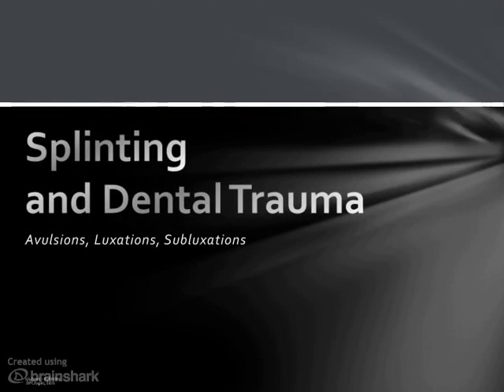In an earlier presentation, I talked about the use of adhesive dentistry techniques to reattach fractured tooth fragments. Today, we will discuss using those same techniques for splinting of teeth that have been displaced from the tooth socket. Avulsion refers to a tooth that is completely removed from the socket.